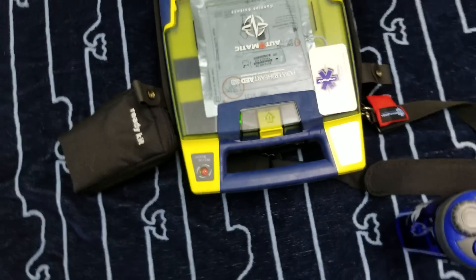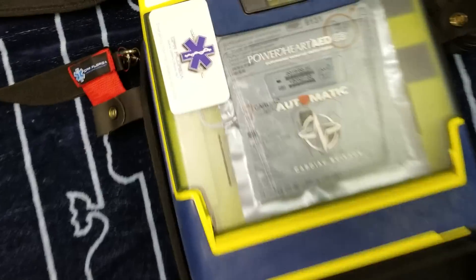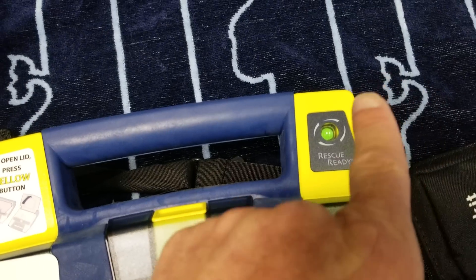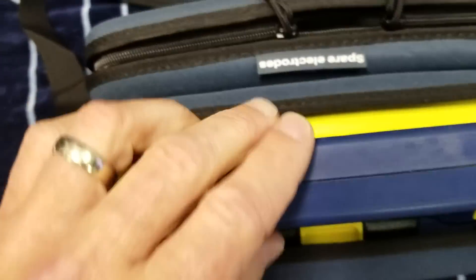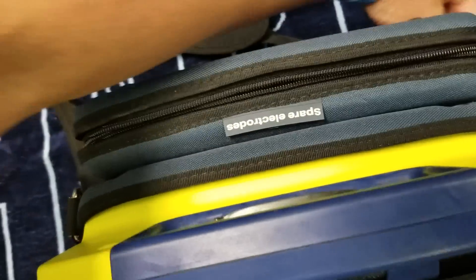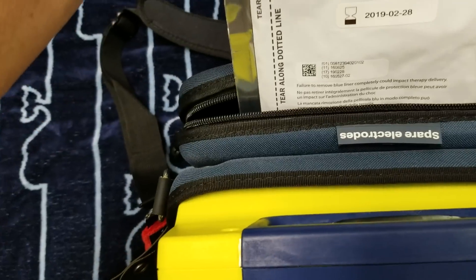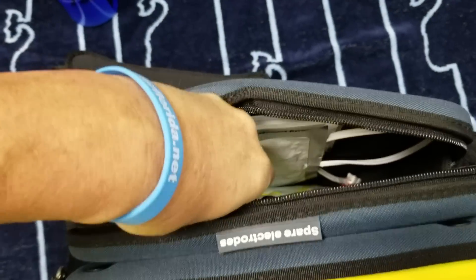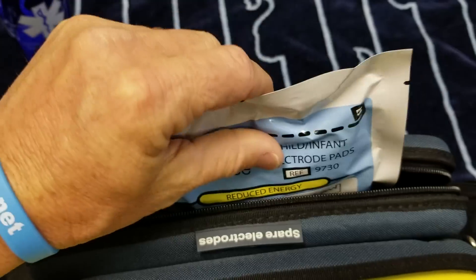As you can see, the indicator is now red — it'll turn green in a second — and now it's green again. Always make sure you have extra pads. Check inside here and in the back of the Power Heart G3 defibrillator. You can check for adult pads and, if you need them, pediatric child pads — always make sure you have a fresh pair as well.